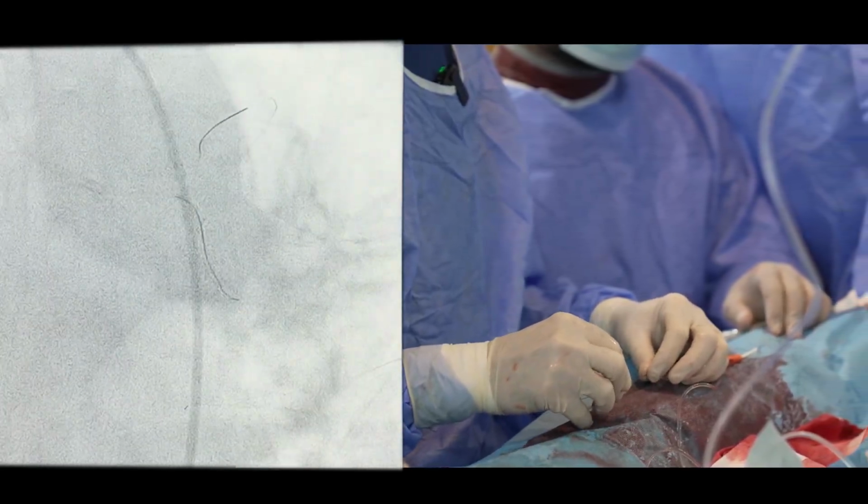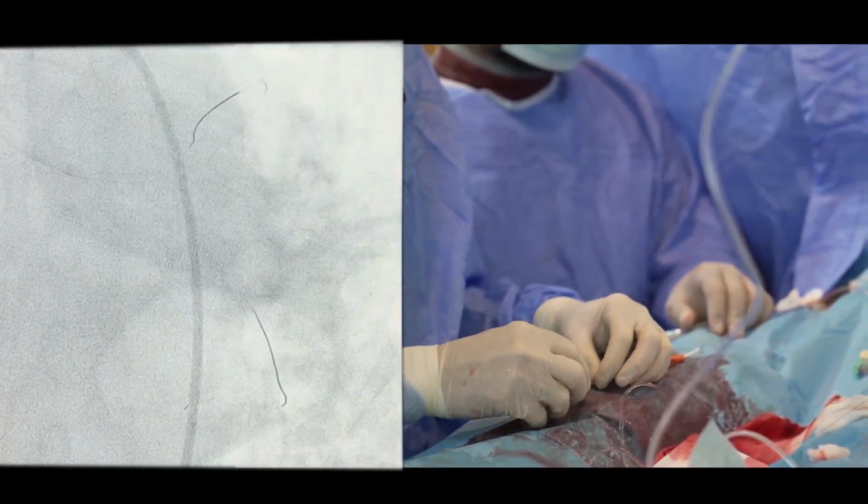Okay, that was not difficult. So IVUS for the circ.